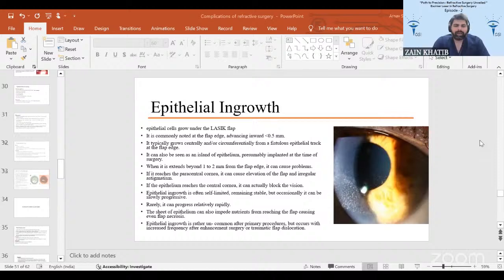So I think lenticules probably have a smaller optic zone than LASIK. So probably that is why, in the higher refractive errors, you may get a little more epithelial remodeling as compared to what a LASIK would give. So that could be one of the reasons why you are getting that epithelial heaping up. And that's why for these higher powers, I started to enhance the zone by another half a millimeter. But then if I do that, the amount of tissue I'm taking is more. So that's why I started doing ICL instead now, to put it another way.